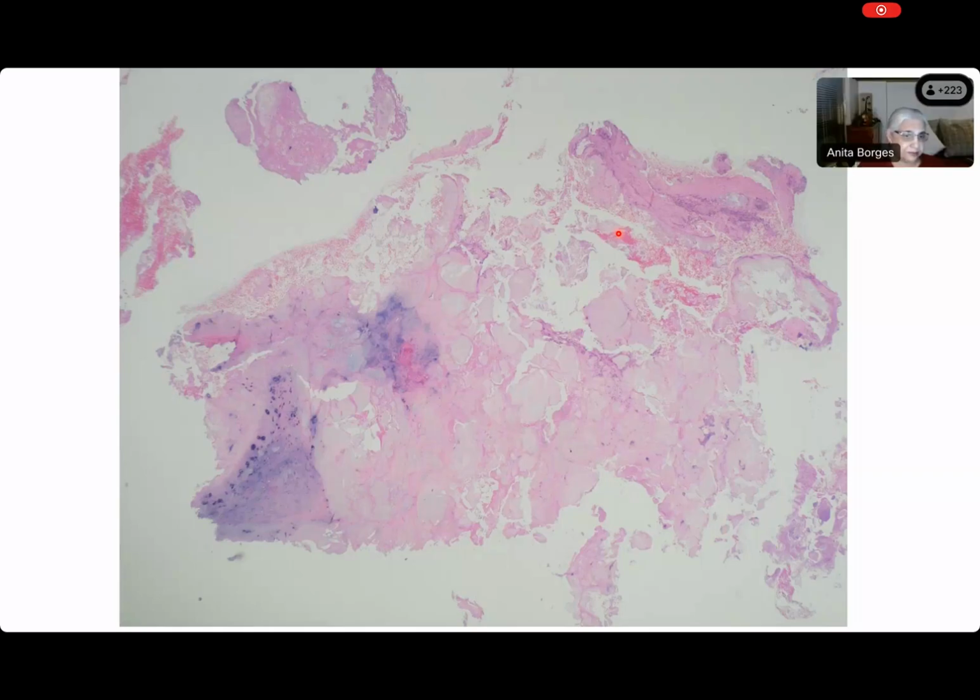Is it possible? No. Can you make an omelette without breaking eggs? No. Right. So there will be some. You know, this is a way, Mansi, of getting away from describing what you should be describing. You said there are some myxoid areas. Now, Mansi, you want to show me this myxoid area?